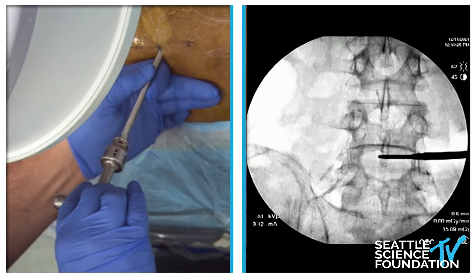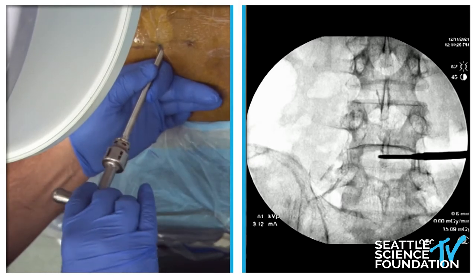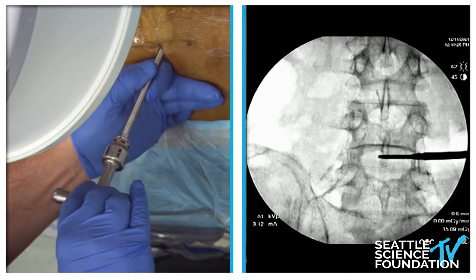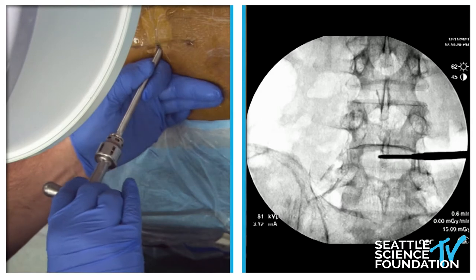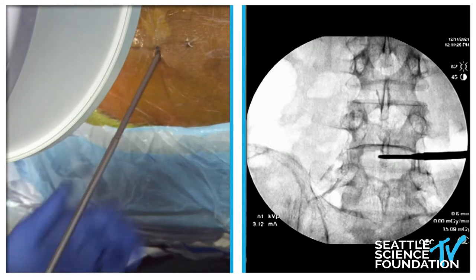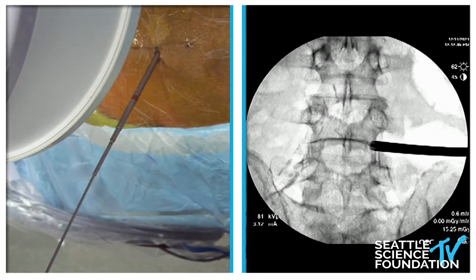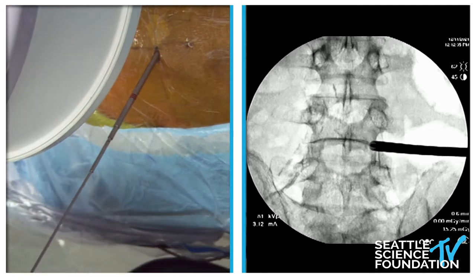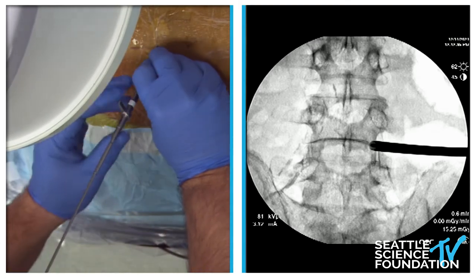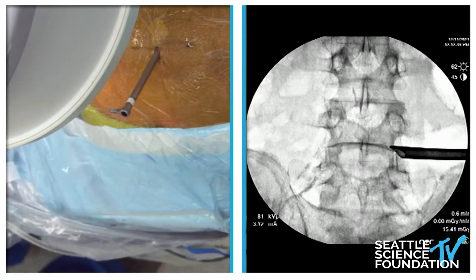This technique is screaming for robotic application — it's very repetitive and it's always the same. The trick with reaming is you pivot on your index finger because the SAP always pushes you to the side, and then you medialize it in a scraping motion to take down a little bit of that SAP. The Jamshidi needle was anchored within that, making it a very reproducible, safe technique. Let's get a shot — we've got a tube there. Now we can take a look.